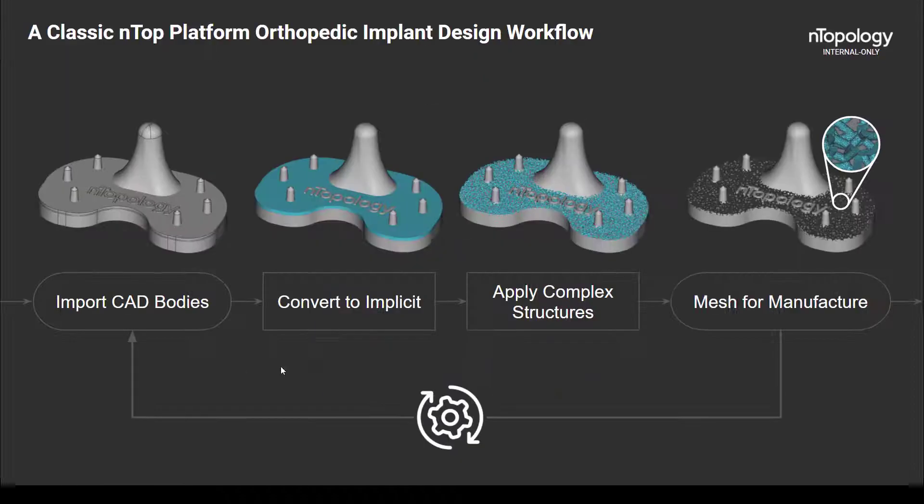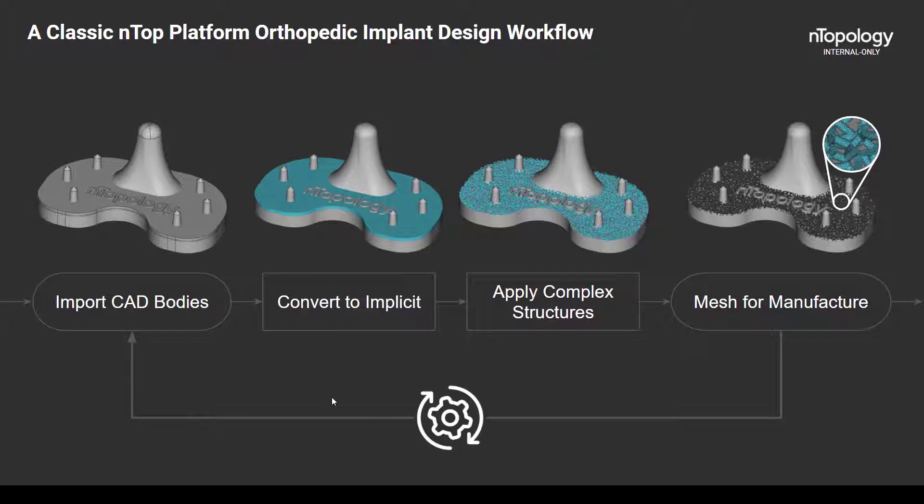Now, the classic nTop Platform orthopedic implant design workflow, that's quite a mouthful, it's fairly intuitive and consists of four major steps. The first is to import your CAD bodies, and though we take in native SOLIDWORKS part files, step files, and the like, the most compatible format to work with is actually the parasolid.